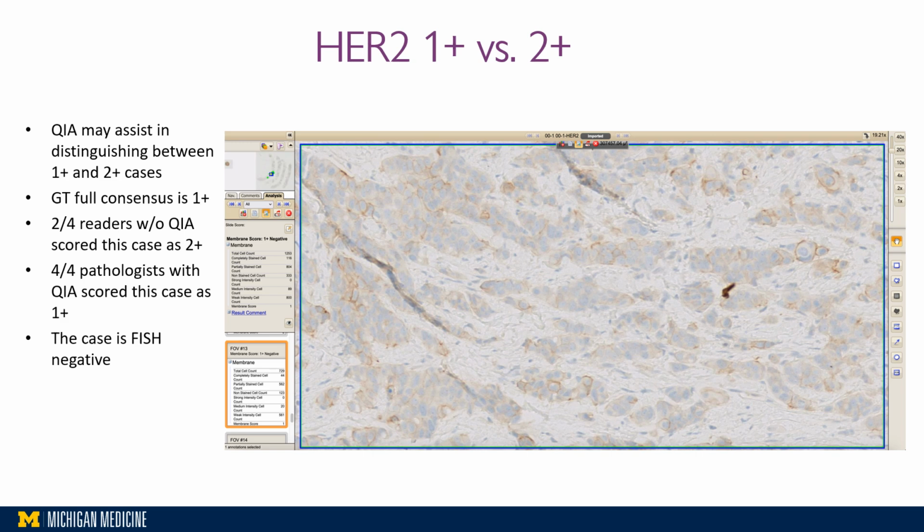Additionally, this case was also found to be FISH negative when we performed FISH, which underpins the reliability of quantitative image analysis in accurately determining the HER2 status in challenging cases.